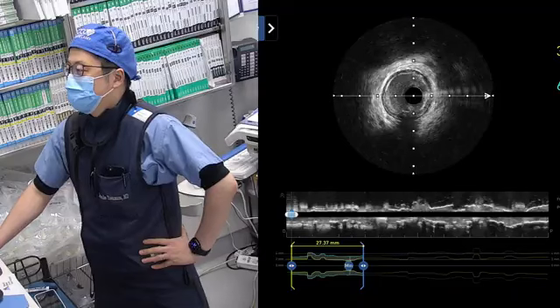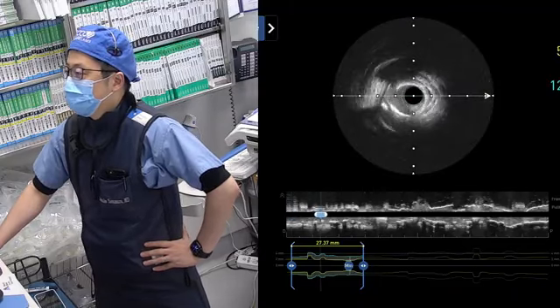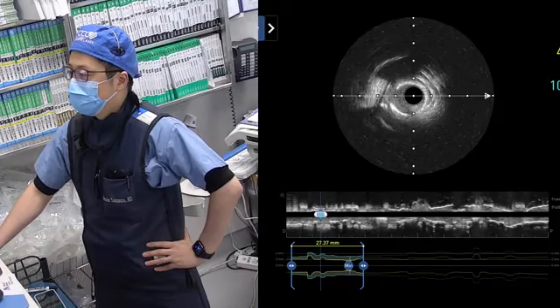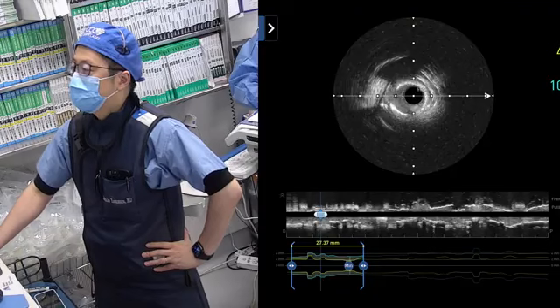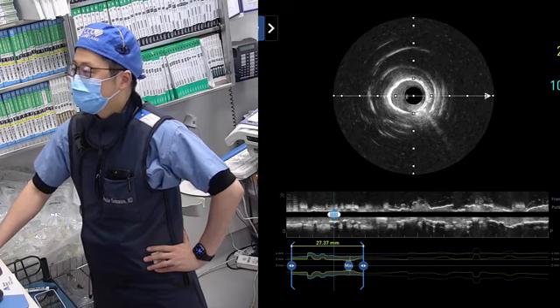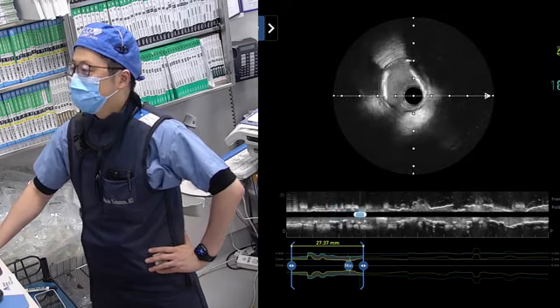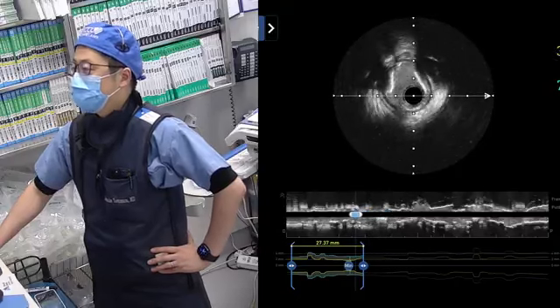Yes. And the start of the pullback is like a 2.8 vessel. And the distal lesion, this is after the rotor. I see some like a crack even just by the rotor, but still a lot of calcium. And I see reverberation. It means the surface of the calcium is shaved. Okay. So yeah, multiple reflection. But here, still distal RCA, this has circular calcium. Yes, 360 calcium. We might need additional something. Huh? I mean we might need more.